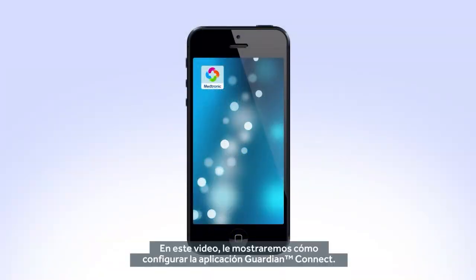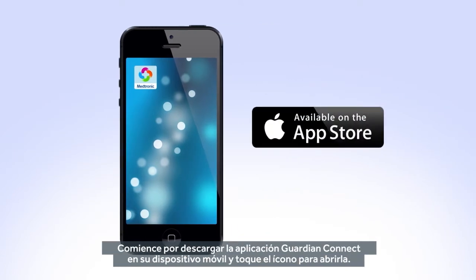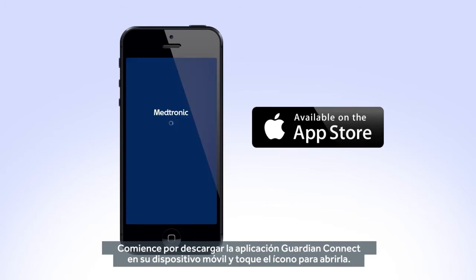In this video, we will show you how to set up the Guardian Connect app. Begin by downloading the Guardian Connect app to your mobile device and tapping the icon to open it.